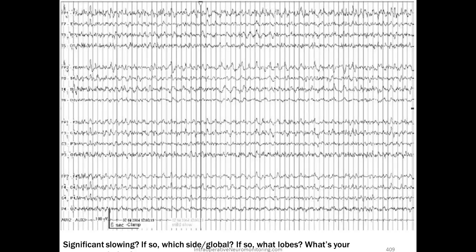So if you see this, we can see it really prominent right there. We see this changing in patterns. The first thing you should do is let's try something palliative. Let's not do another surgical maneuver that's risky in itself. Let's increase the mean arterial pressure, and this is probably what they did here, and we start to see a little bit of improvement. We see the fast activity falling off. We see some theta wave activity, so the slowing is starting to become more prominent, and then they make some changes, and we start to see some of that alpha wave coming back.